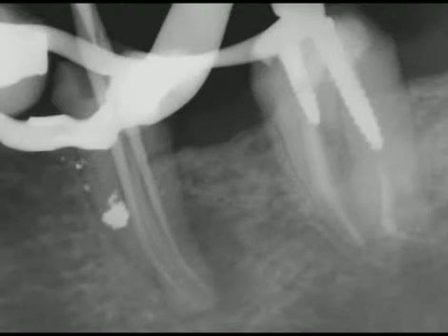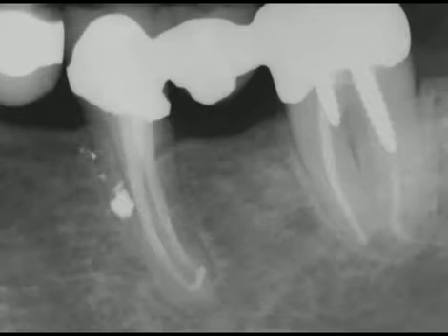This working film shows 2 gutta percha cones at length in the MB and ML systems. A post-treatment radiograph reveals 3-dimensional retreatment. Note the 3rd mesial system between the MB and ML canals with its own apical portal of exit. The 8-year recall film demonstrates a new bridge and excellent periradicular healing.